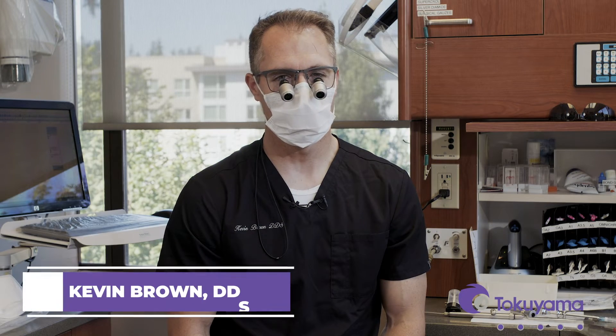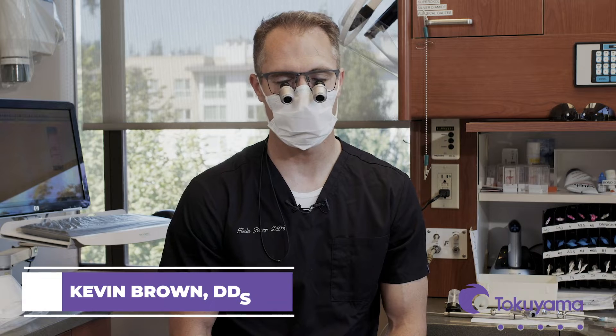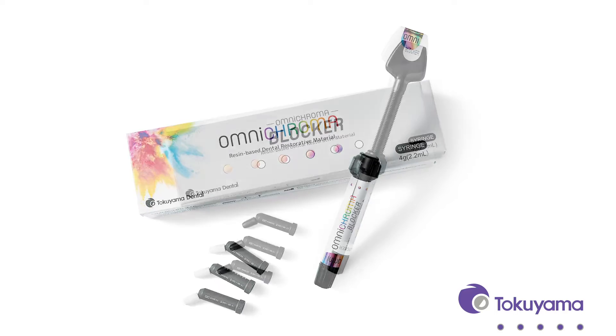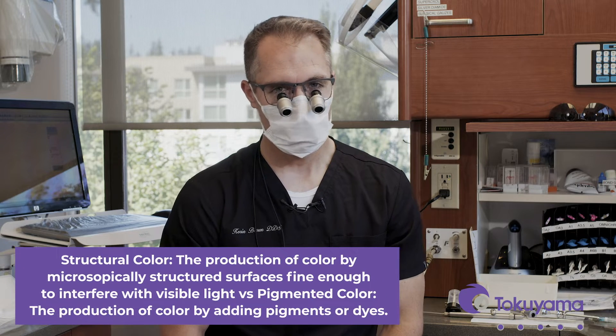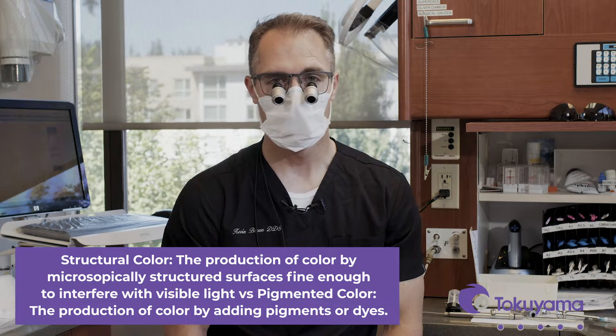Hi, I'm Dr. Kevin Brown and we are here to highlight the newest composite by Tokuyama, the Omni Chroma and the Omni Chroma Blocker, and the different ways that we can use this composite in the mouth. It's a universal composite and it's a single shade, so it will match any color of any tooth. It's an incredible thing and the science behind it is structural coloring versus pigmented coloring. Today we're going to show you how to use it in the posterior on a standard class 2 composite.